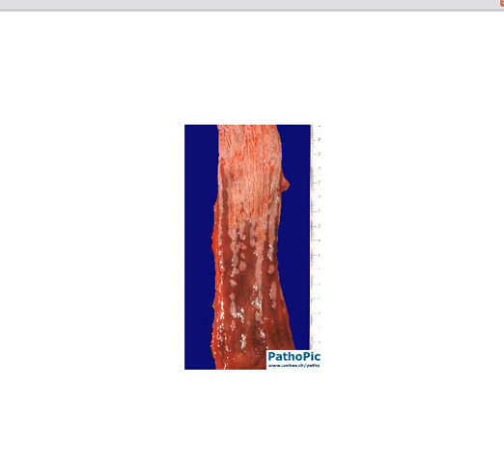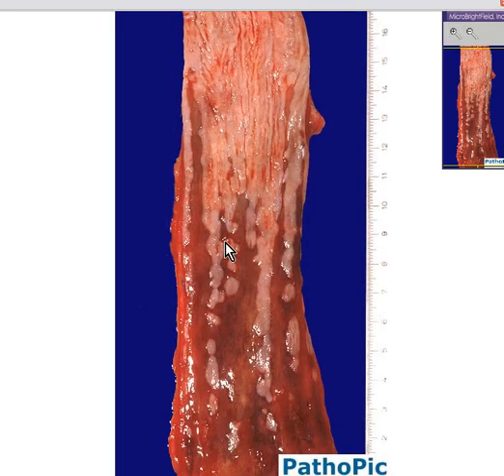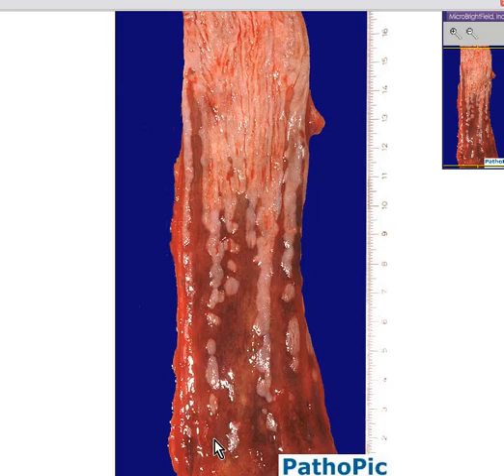Here is another example of Barrett esophagus, perhaps from an autopsy. We have squamous mucosa which is the nice, shiny part, and here towards the lower part of the esophagus this squamous portion becomes lesser and lesser, replaced by a gastric or glandular type of mucosa.